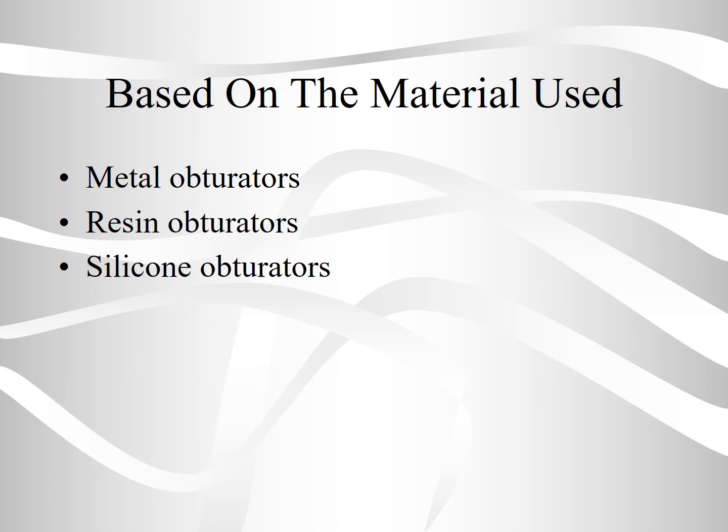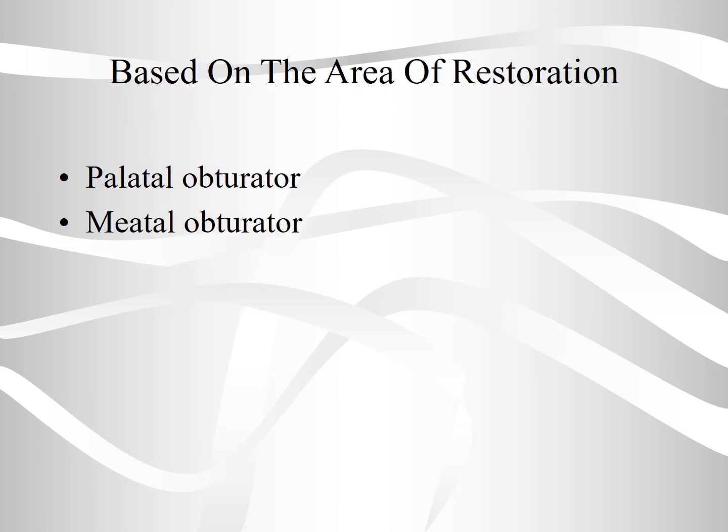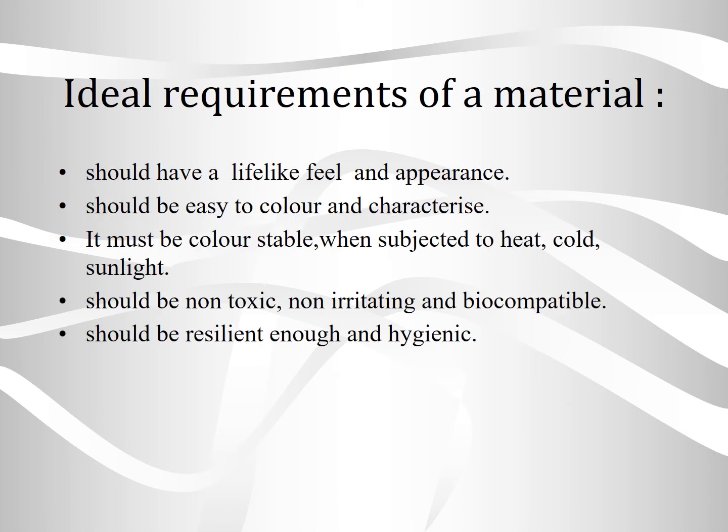Based on the material used, obturators can also be classified as metal obturators, resin obturators, and silicone obturators. Based on the area of restoration, they can be divided as palatal obturator or meatal obturator.